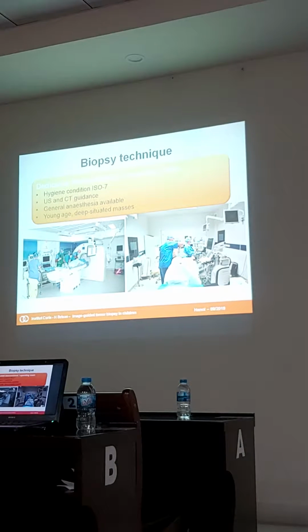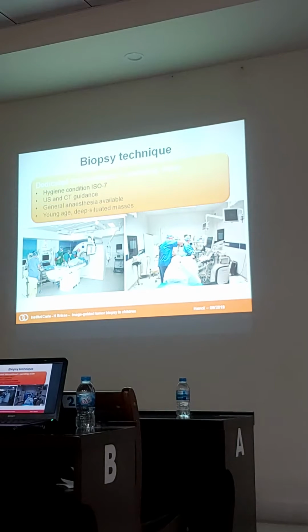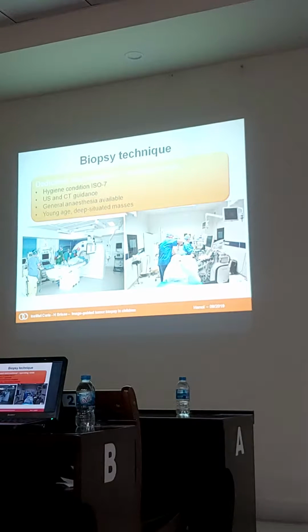So you do it with either ultrasound guidance or CT guidance, depending on the situation of the mass, but you do this in an operating room.